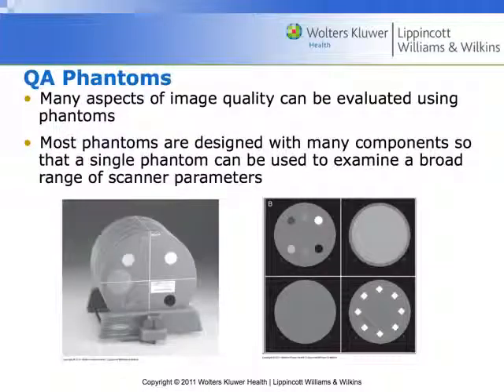So here are the QA phantoms that we use for a lot of these tests. We love our QA phantoms. We want to be very gentle with them. Don't be joshing around and playing football with them. Most are designed with a bunch of components inside them so that a single phantom can be used for a number of different scanner parameters, right?